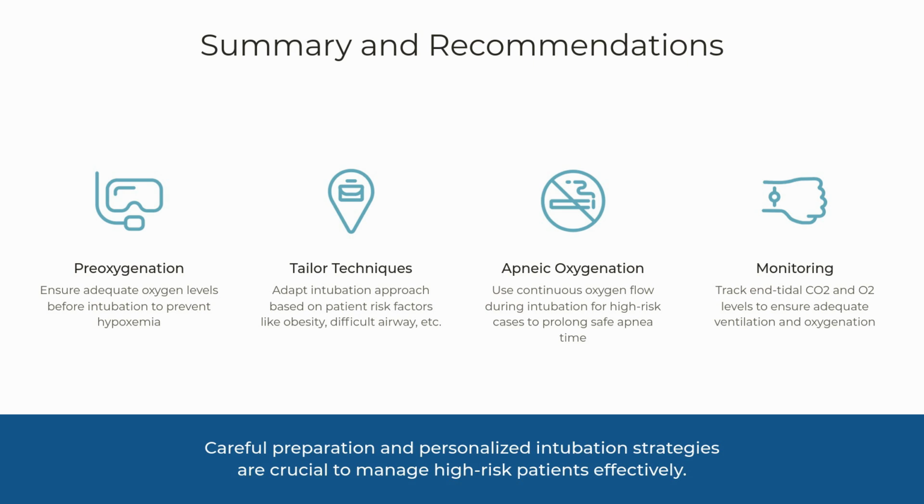Apneic oxygenation is a valuable tool for high-risk patients, like those with obesity or lung disease, extending safe apnea time. If able, monitor end-tidal oxygen during preoxygenation and transcutaneous CO2 during apneic oxygenation to ensure effectiveness and safety. These strategies, when applied thoughtfully, significantly enhance patient outcomes during airway management.